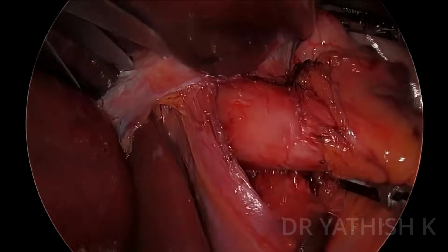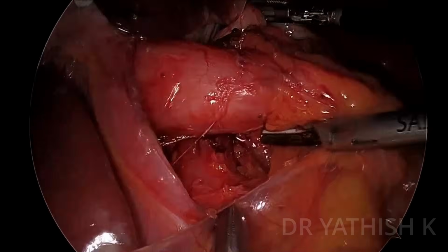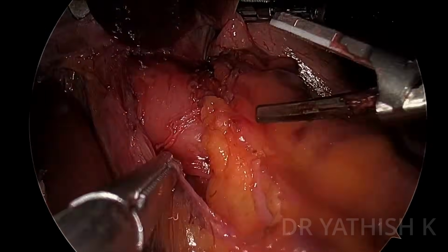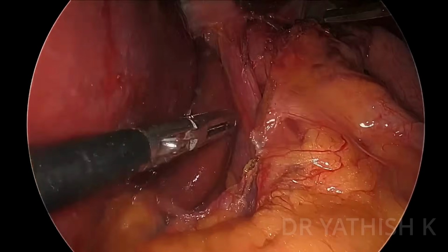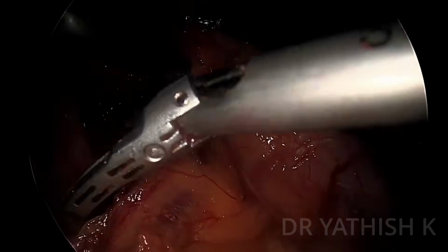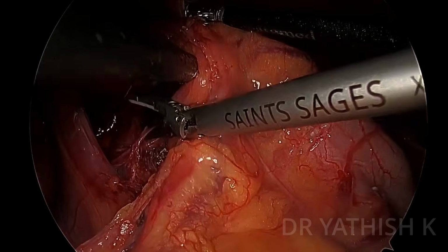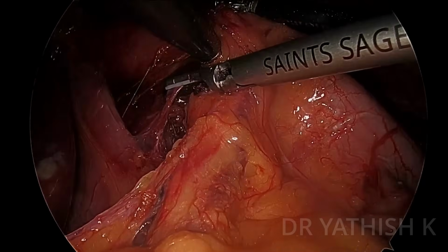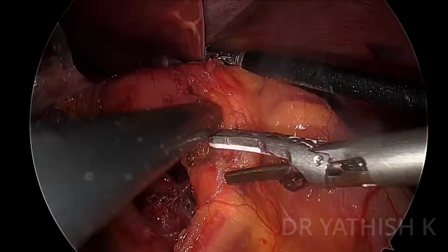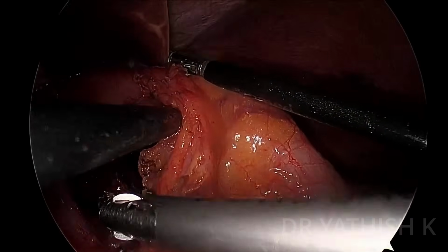There shouldn't be any untoward or extraneous retractions; basically, you should respect the tissues. That's what I'm trying to tell. Once you respect the tissue and make clean movements, you'll have a really good bloodless field. I'm just taking down those few attachments of the fundus to the left crus.